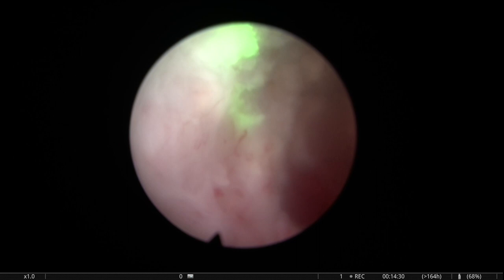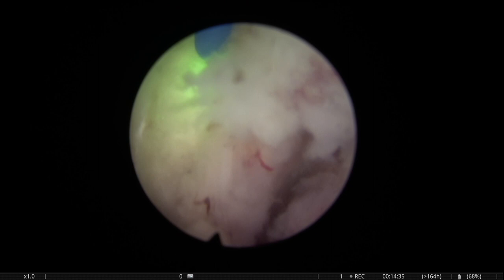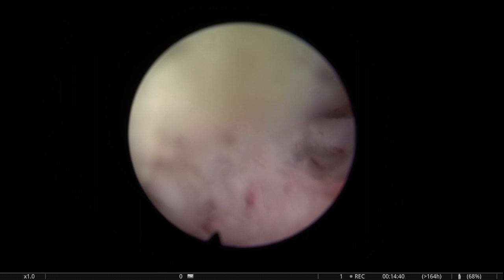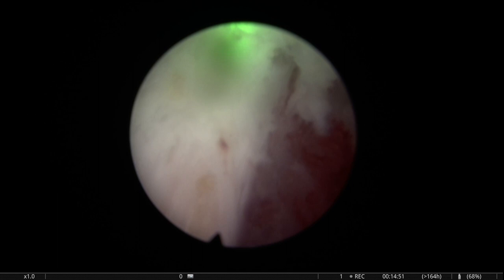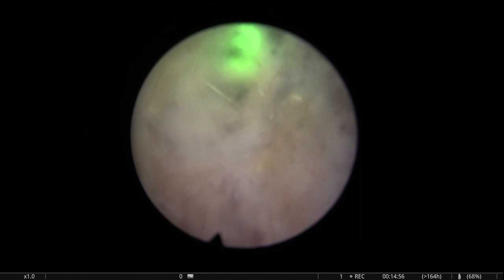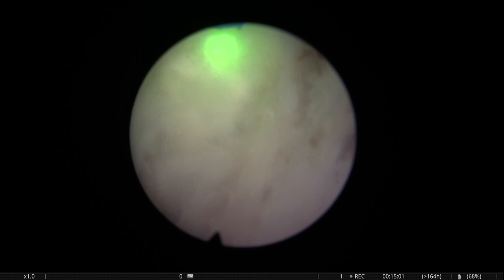And also, in my way of thinking, when you use higher power, possibly you move much faster around the capsule. So despite using more power, the time of contact of the laser with the capsule is less, you know. So I'm not sure that the laser determines what happens to the capsule. I think it's the surgeon who will overheat or overcoagulate the capsule or not.